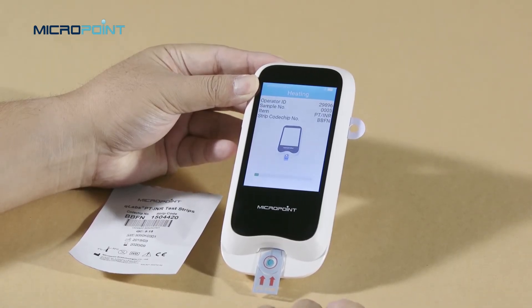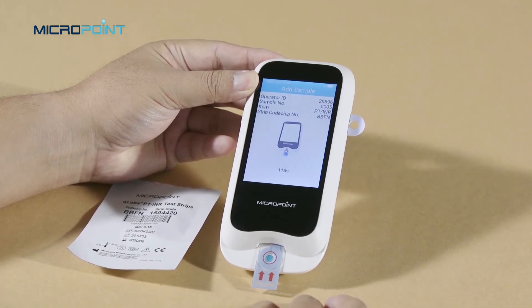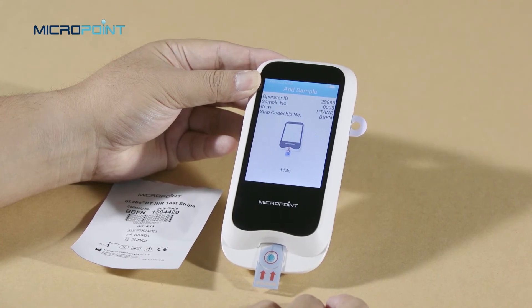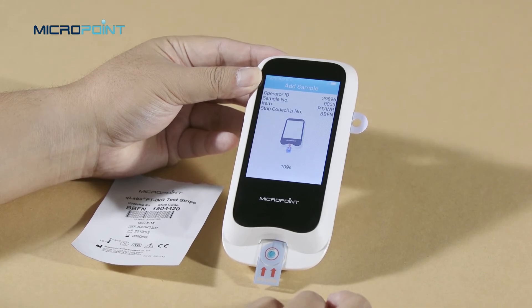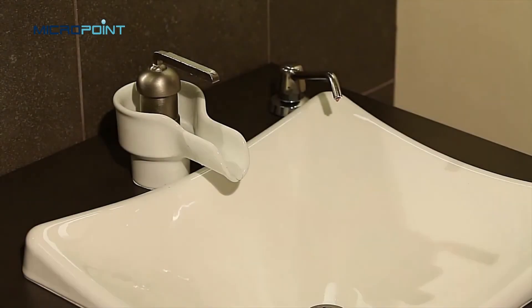After the test strip is inserted and its code chip is installed, the instrument will enter the heating state and the screen will display the heating progress. Wait to puncture until the heat-up is over and the 120-second countdown begins.